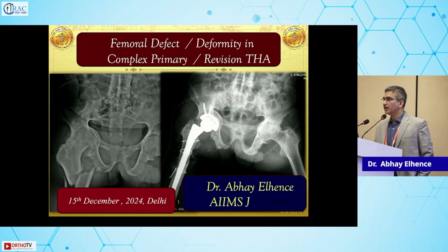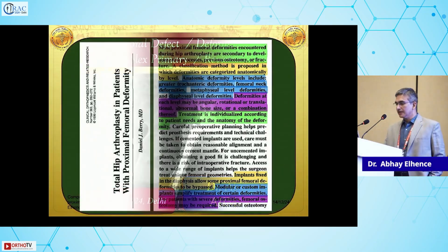So if a hip is gone, inside or intrapelvic, very often you will need to do an ETO to get the hip out and then deal with the hip deformity as well as treat the femur deformity. Very often, you want to restore the hip biomechanics, and you have a femoral remodeling defect. You will have to understand, recognize and deal with it, and choose an appropriate stem which will give you the perfect balance on the femur side to be able to have a stable, well-balanced hip.